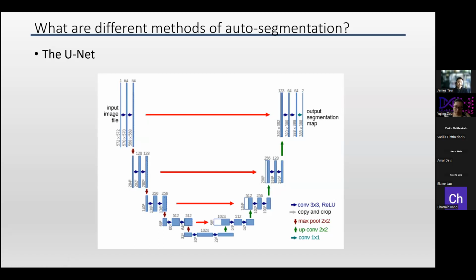Basically, it gives the skip connection the ability to mitigate a little bit the idea of vanishing gradient. If you have a very deep learning neural network, what happens is if you keep going deeper and deeper and deeper, and if you start taking the derivative differentiation during the learning process, your gradient can become small. And when it hits 0, then basically the whole neural network collapses and stops learning. So the skip connection helps with the training process.